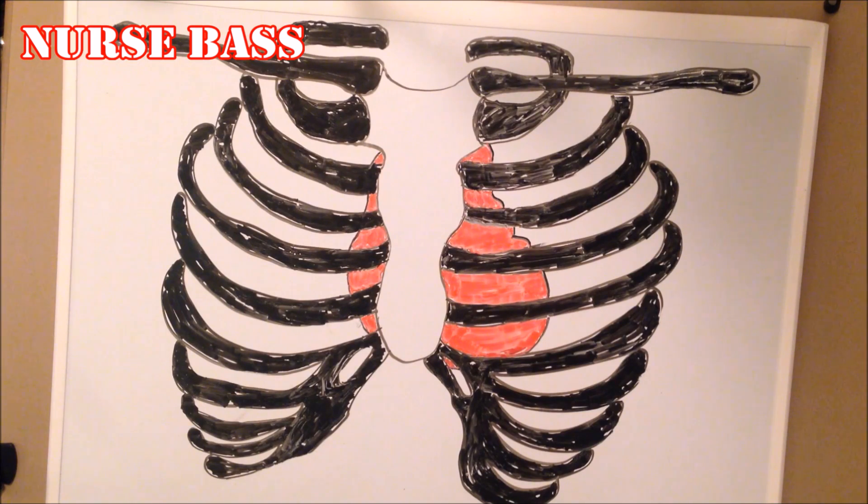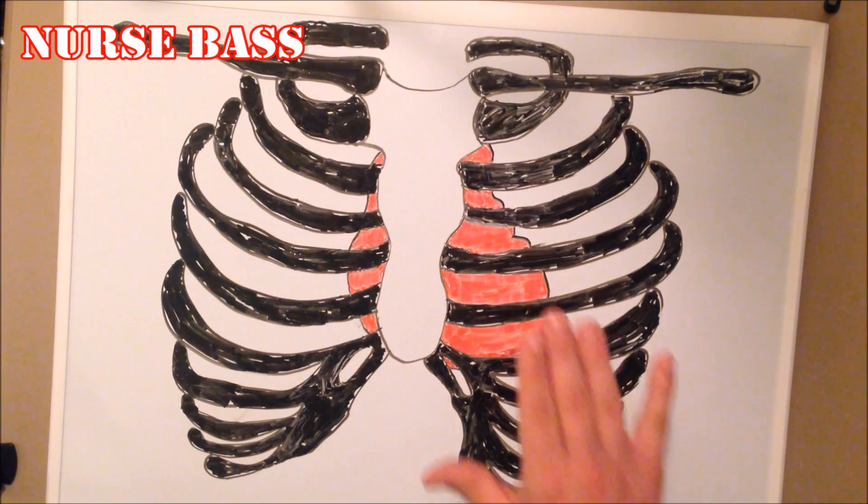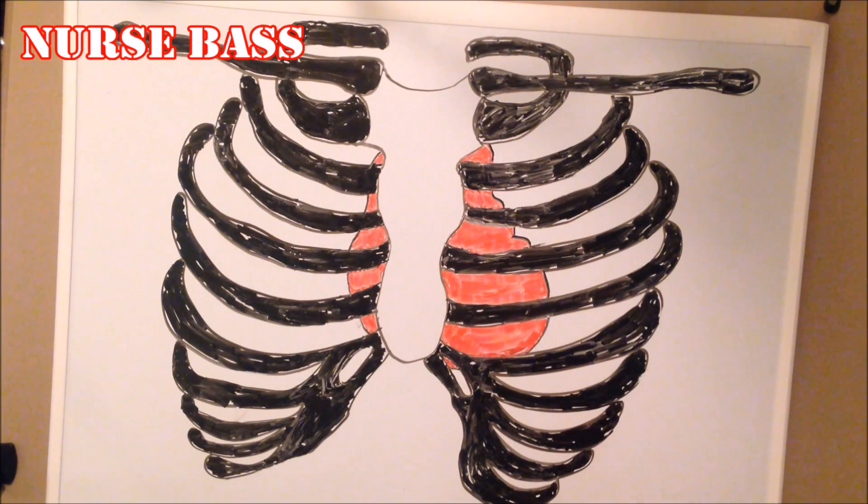There are different landmarks associated with these various points. Also, whenever we talk about aortic, pulmonic, or mitral, it's important to know that the place where you put your stethoscope is not the actual anatomical location of the valve — it is merely the point at which the reverberation of the sounds these valves produce can actually be heard and auscultated.